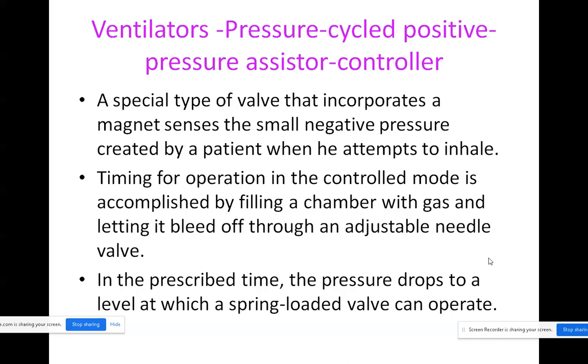Okay, so based on that only you will be providing the oxygen level. The pressure created in the airways of the lungs determines the amount of pressure given to the patient.